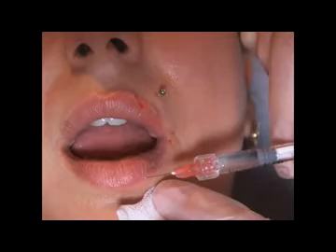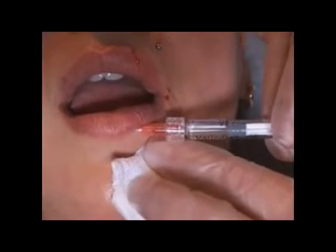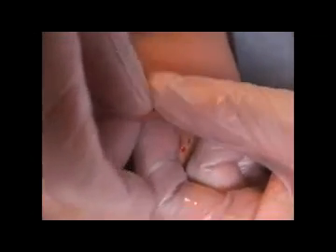Just go to the middle border, give volume. It's very important that you make the massage very early and very effectively. You take the lips between your fingers and you make the massage precisely, so that you feel nothing between your fingers.